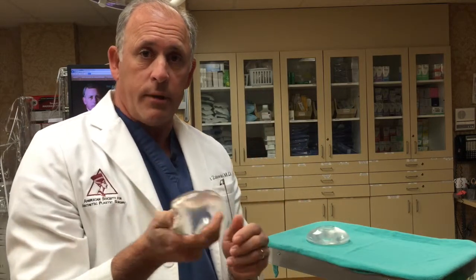These are saline implants. They're filled with salt water, which is absorbed by the body if they deflate, but they feel somewhat less natural than their counterpart silicone gel fill implant. On the other hand, while these silicone implants feel more natural in most patients, and while the risk of rupture is lower than with saline, the gel is cohesive and therefore isn't absorbed. The rupture, in many of these cases, is difficult to detect. Therefore, it's recommended an MRI be performed every several years to evaluate them for leakage.